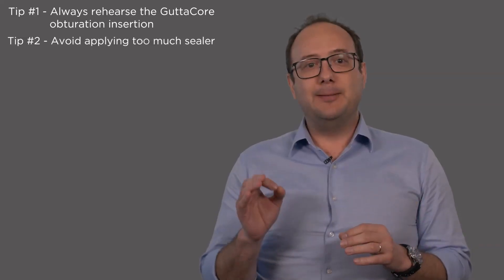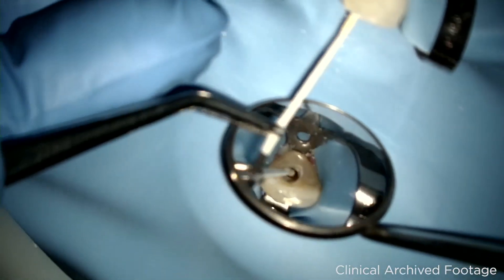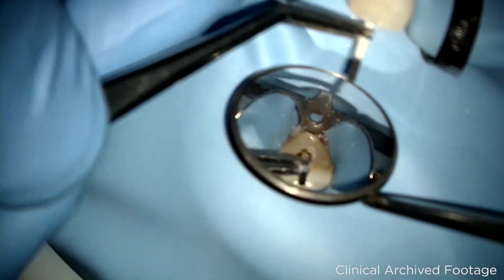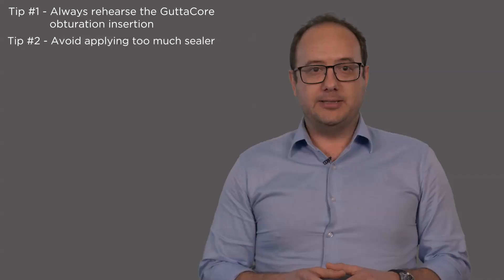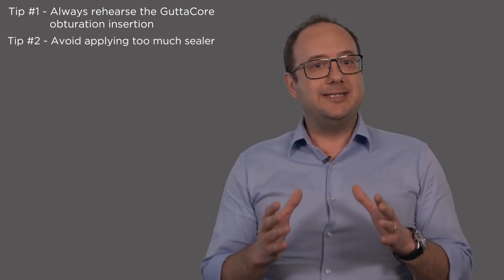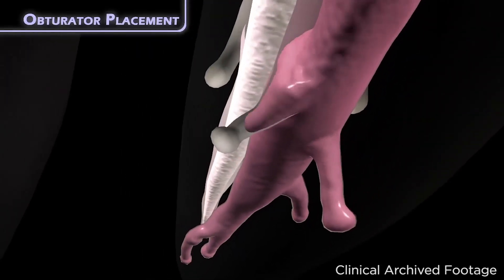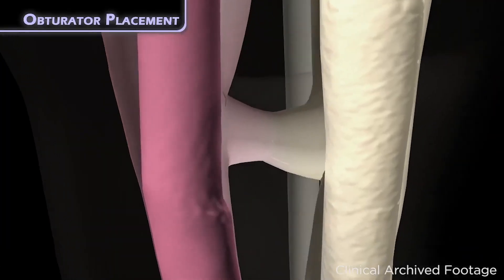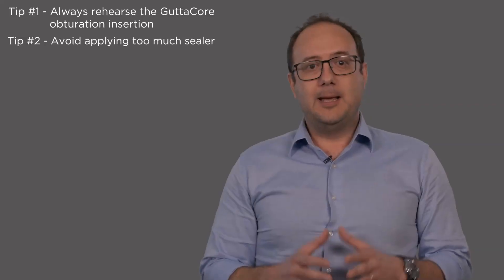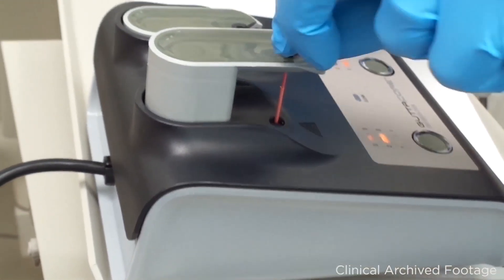The second tip is to avoid applying too much sealer. You can apply it with a paper point, but always remember to wick the excess sealer with new dry points. Hydraulics generated over the warm GuttaPercha will guarantee an excellent distribution of the GuttaPercha mass along the root canal system, so a minimum amount of sealer is needed.